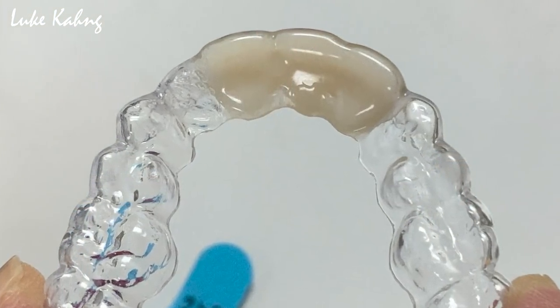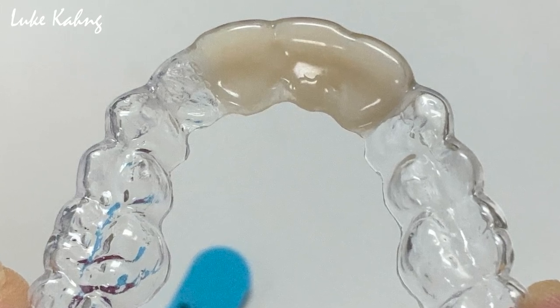First, you can make an acrylic partial, okay? And you could also make the clear stent, just like we did, but this video strictly shows how to make the clear stent for long-term temporary. It's usually 3 or 4 months before they decide to go to a final partial or implant. This is a great guide, but next time I can show you how to make an acrylic partial too.